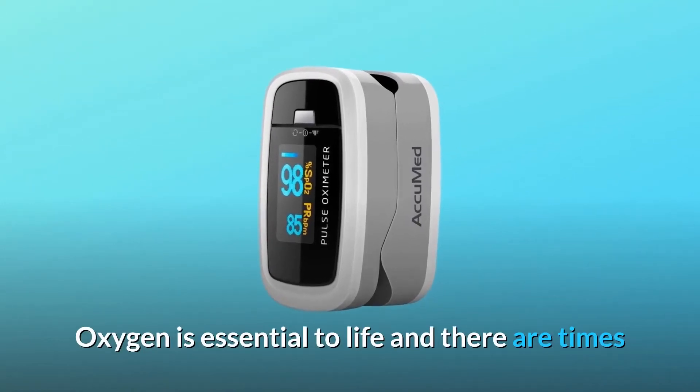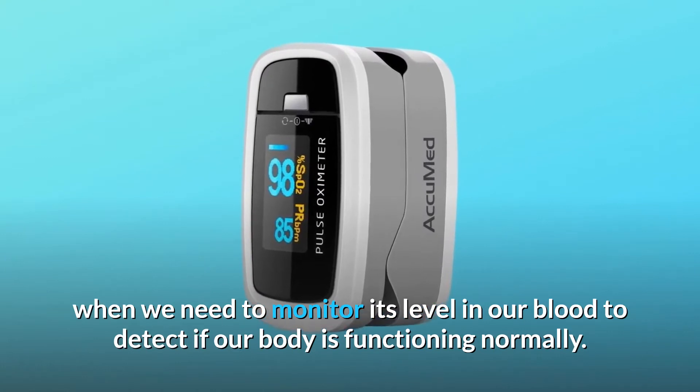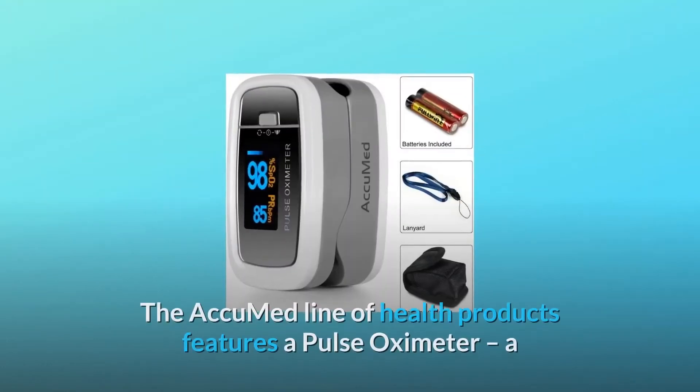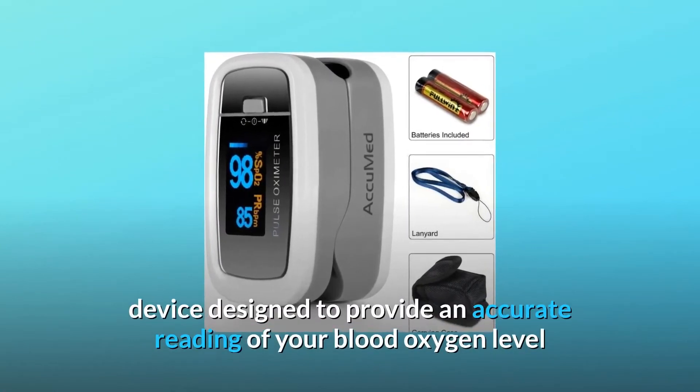Oxygen is essential to life, and there are times when we need to monitor its level in our blood to detect if our body is functioning normally. The AccuMed line of health products features a pulse oximeter, a device designed to provide an accurate reading of your blood oxygen level and pulse rate from your fingertip.